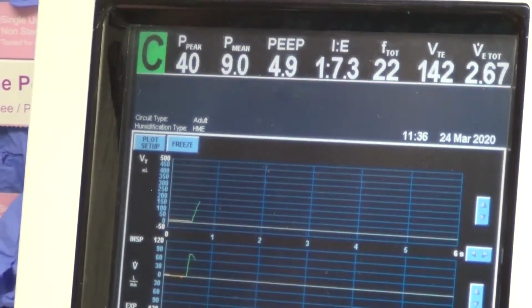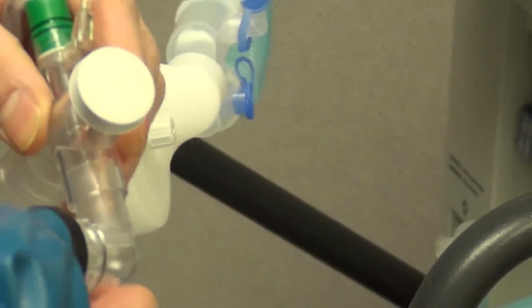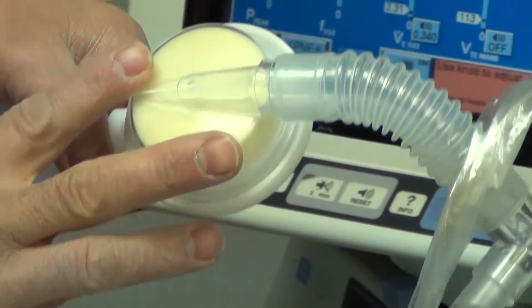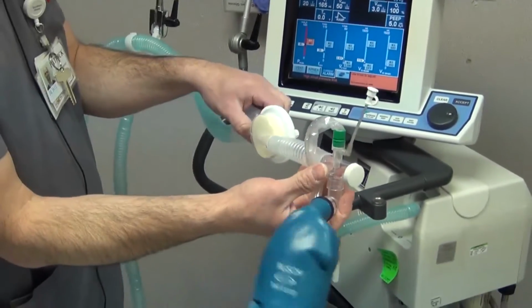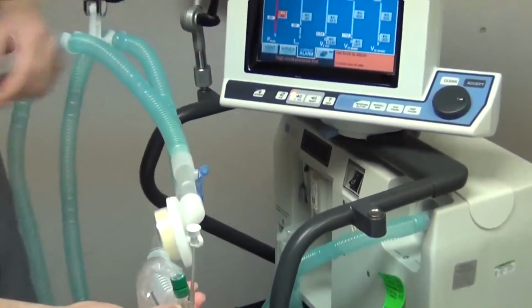This is when you would look at a patient and say, okay, do they need suctioning? Is the tube dislodged? You look at the patient and then work your way up the circuit. One of the problems sometimes is also an HME that has been filled and needs to be changed. Somebody coughed up a big chunk of secretions and it's made its way into the HME and blocked it. Those are kind of things to look for. Okay? You got your alarm silence.